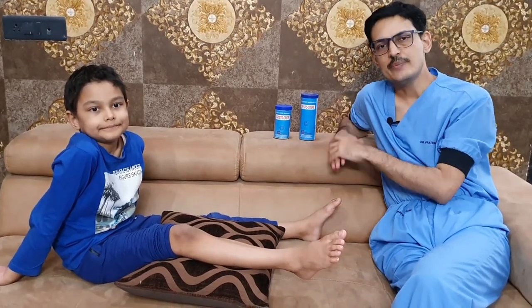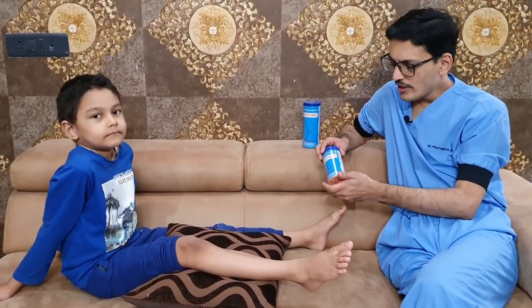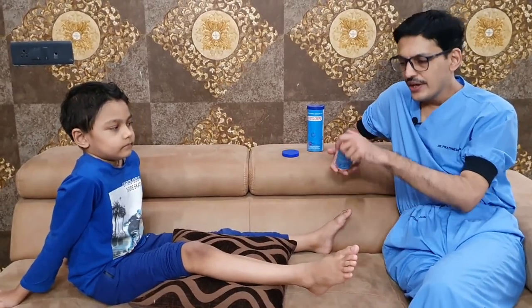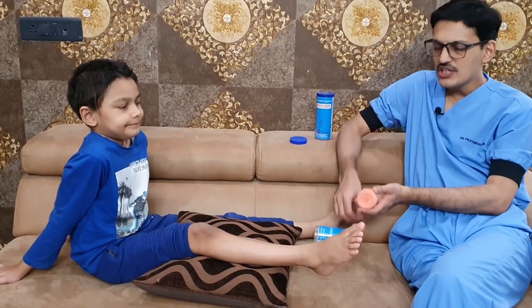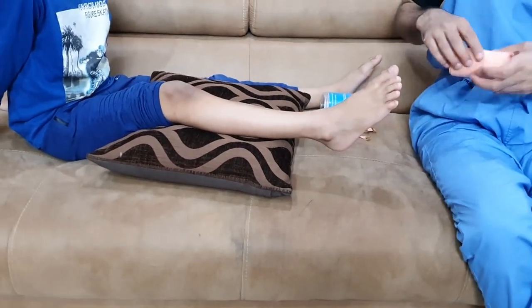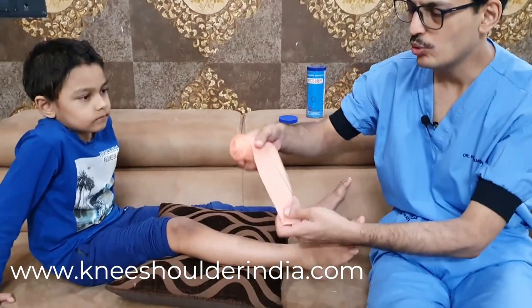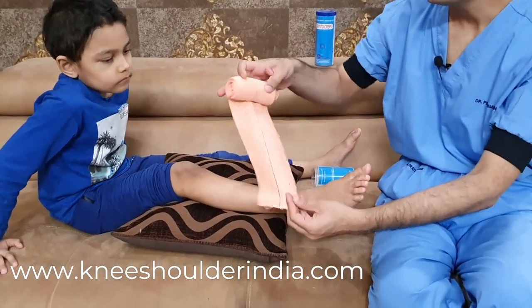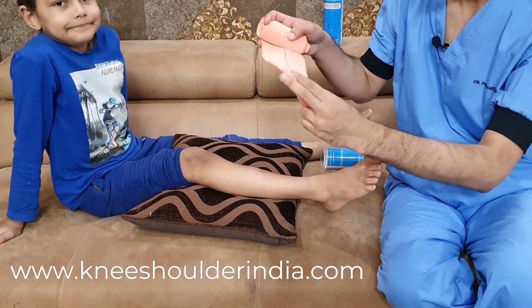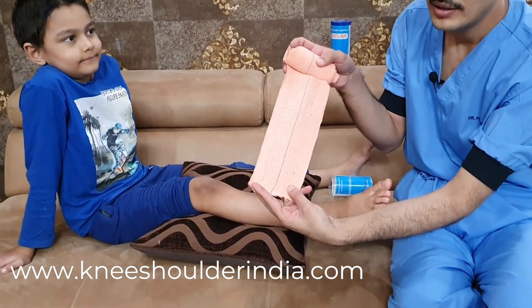Crepe bandage is standardly available in the market in 4 different sizes: 6 cm, 8 cm, 10 cm, and 15 cm. The standard length is usually 4 meters. Here we are using a 10 cm crepe bandage on a child who has suffered an ankle sprain — you can see the swelling in that area. I am going to tell you how to hold a crepe bandage. You must hold it like this; a common mistake is people hold it the other way, which makes it difficult to apply. Always hold the bandage with your thumb and ring finger positioned correctly so rolling is controlled.